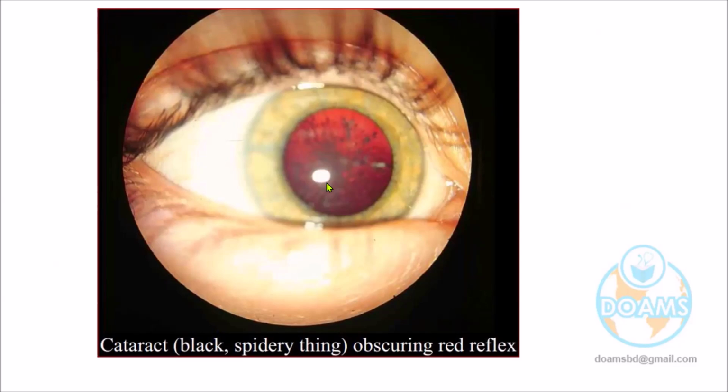Light reflex. Yes, it is. It's a technical thing, an artifact rather. It is actually not the picture of the retina. It is the focused light reflecting back to you. Hopefully it is easy to understand, right, doctor?